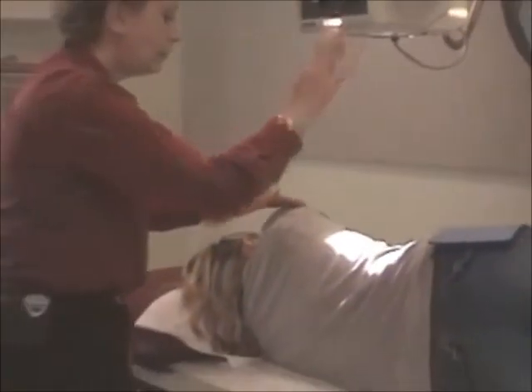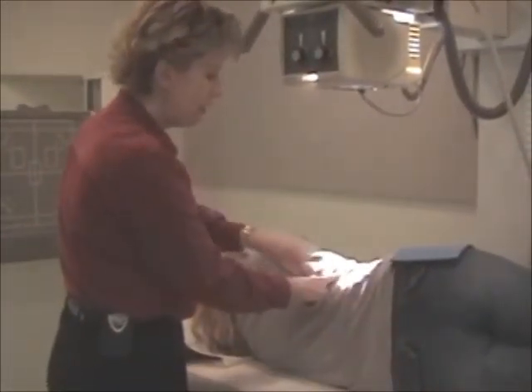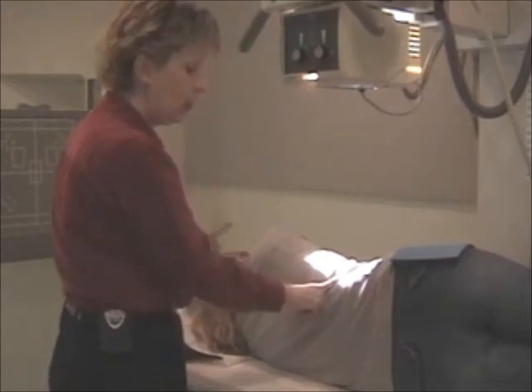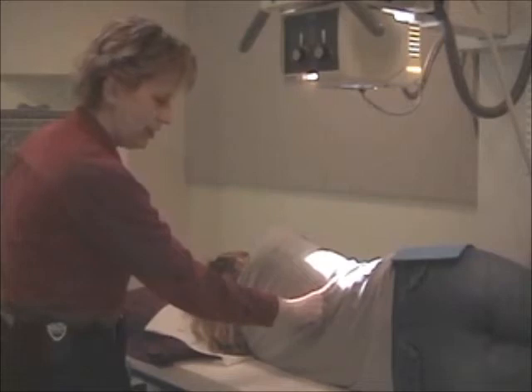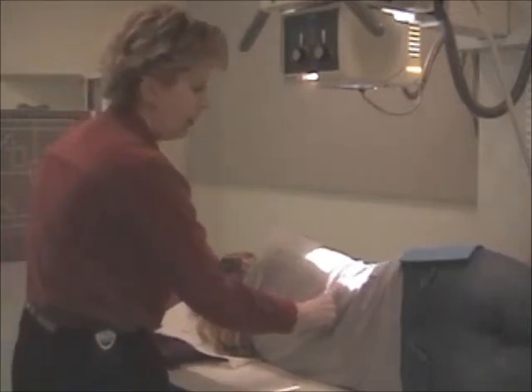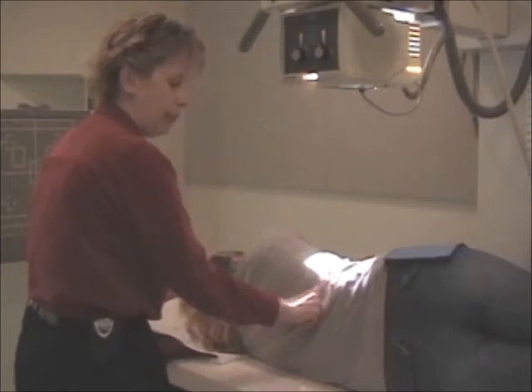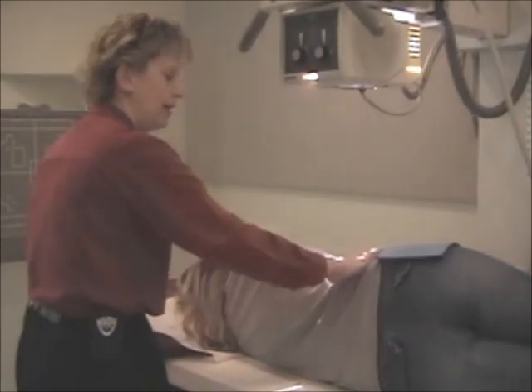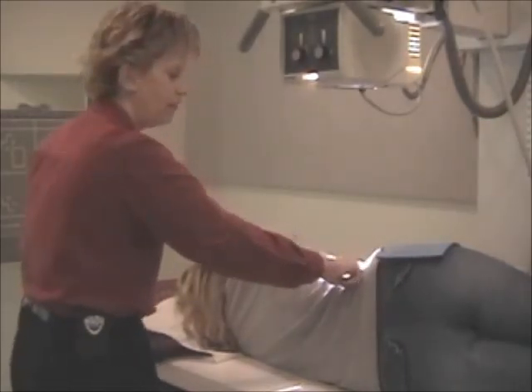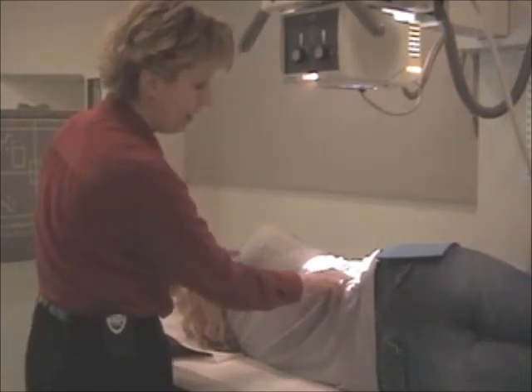Okay? So this would be a left lateral, tip of scapula, iliac crest, halfway and then down an inch. This would be for sthenic. What if she was hypersthenic? What if she was larger? This is sthenic. This would be hypersthenic. This would be hyposthenic. And this would be asthenic. Again, approximately the level of L1 or L2. And if she was really tiny, we're actually at the level of L3.